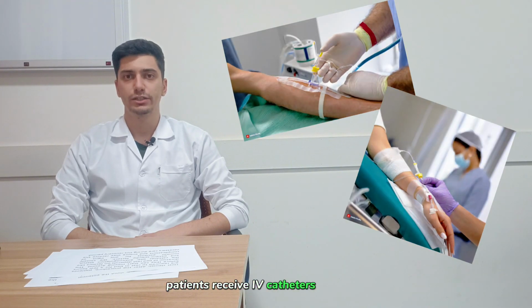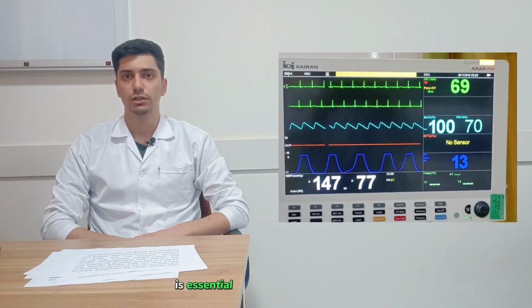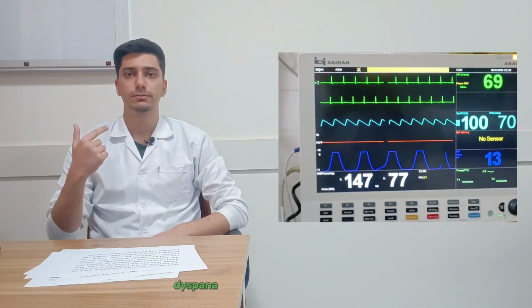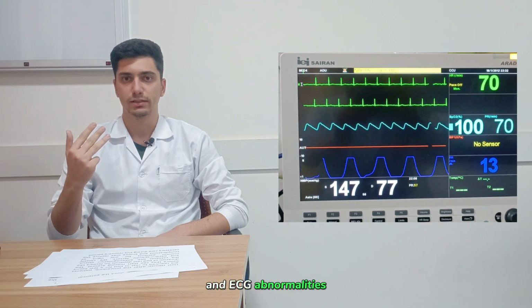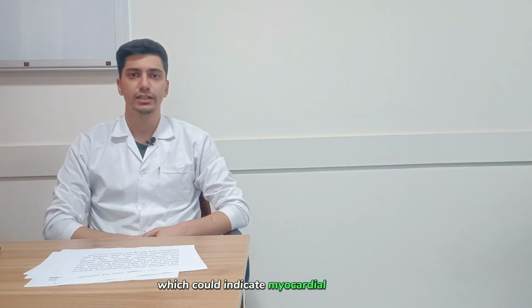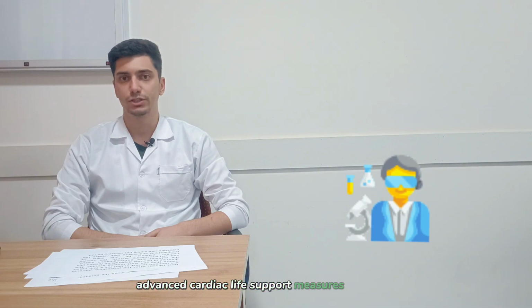During the procedure, patients receive IV catheters for fluids, sedatives, and contrast agents. Continuous monitoring is essential to watch for chest pain, dyspnea, changes in blood pressure, and EKG abnormalities, which could indicate myocardial ischemia or other complications. Our dedicated cath lab nurses are always prepared to provide advanced cardiac life support measures if needed.